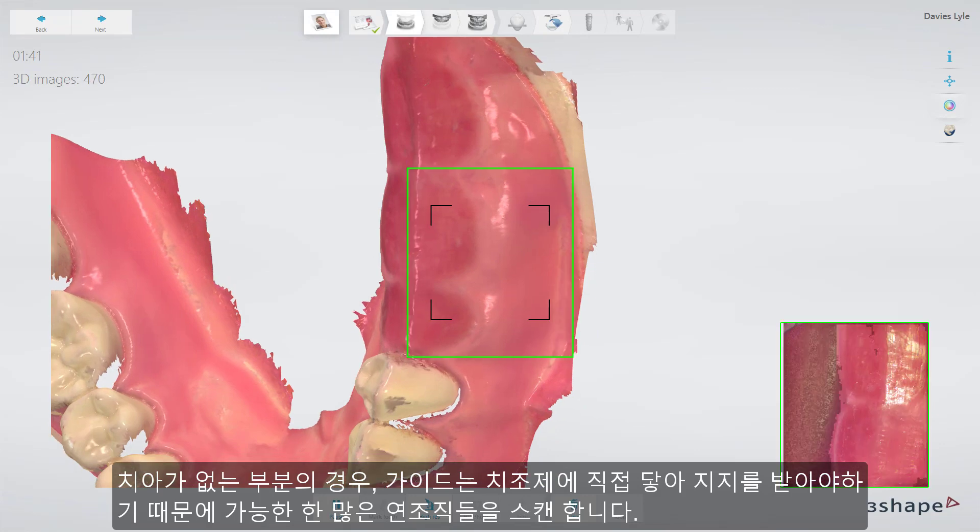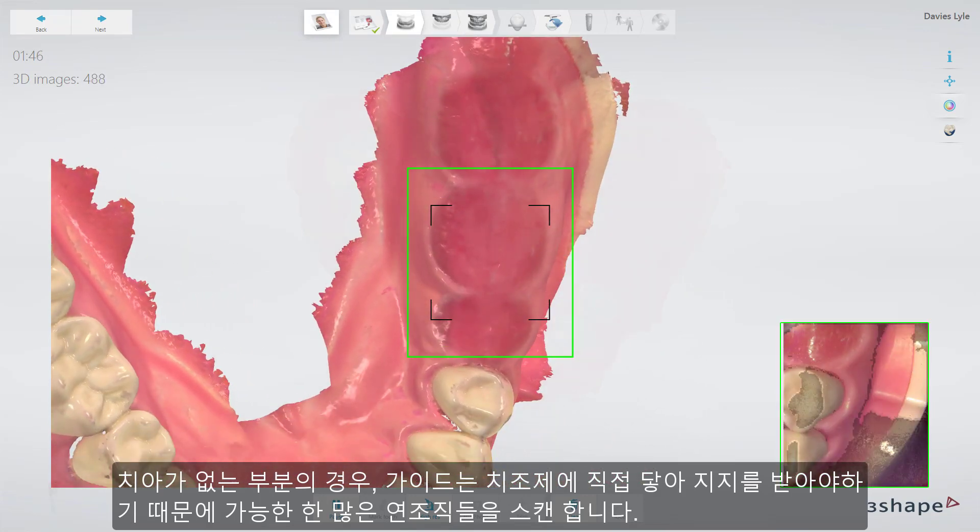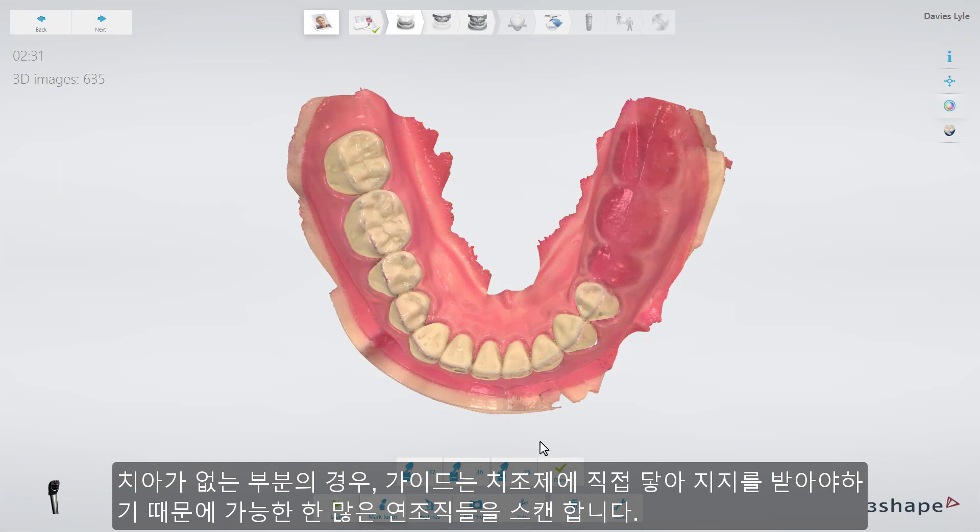For toothless areas, scan as much of the soft tissue as possible, because the guide will later rest directly on the crest and get support from it.